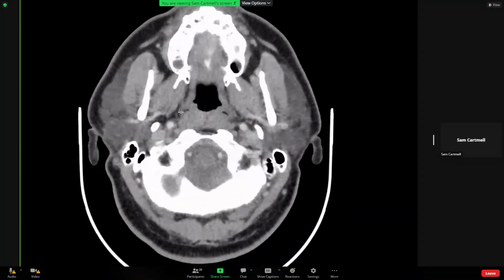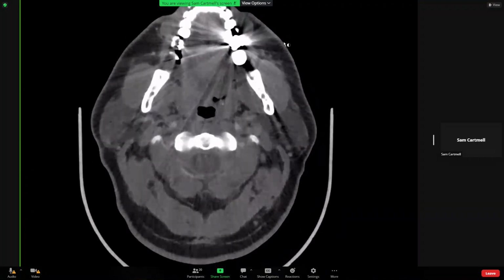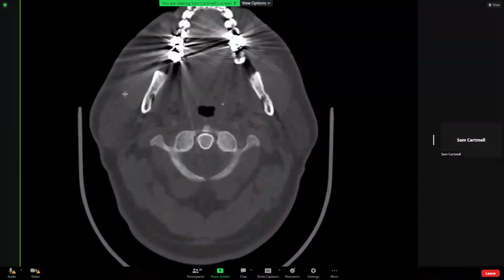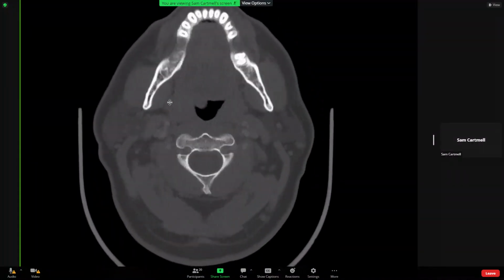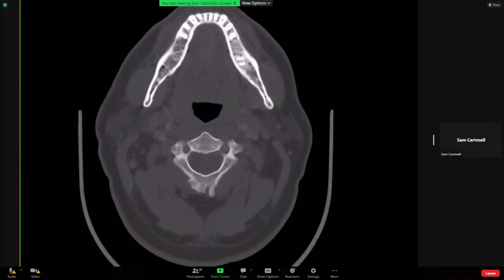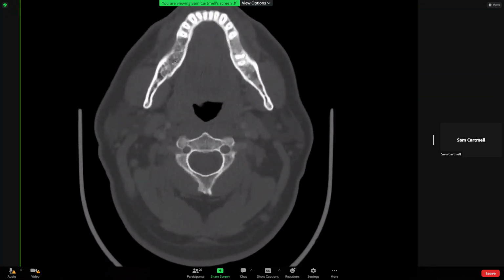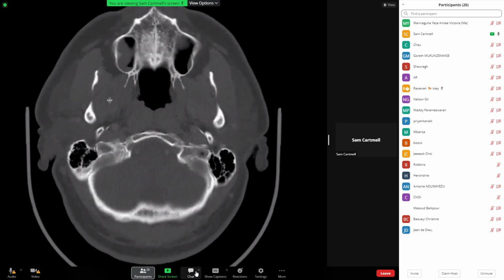to the skull base that way. And then you can also see, if we're looking at the masticator space, which again is right here, say this person had a periapical lucency or some sort of odontogenic infection, they're actually missing some teeth, so normally they go a little bit further back. But you can imagine how an infection with a periapical lucency, say it transgressed this cortex, would then be involving the masticator space and spreading up.